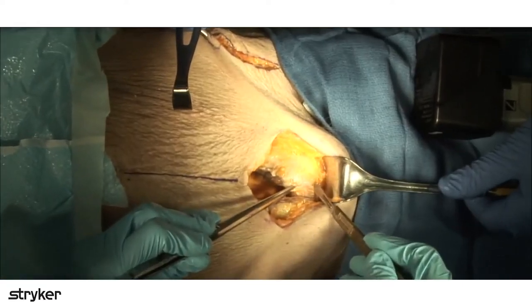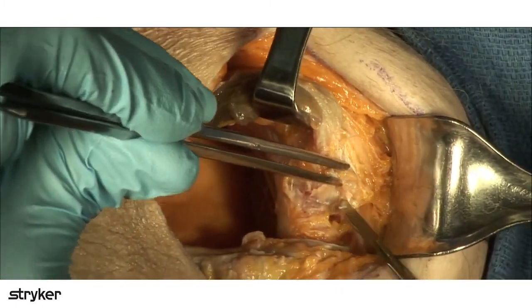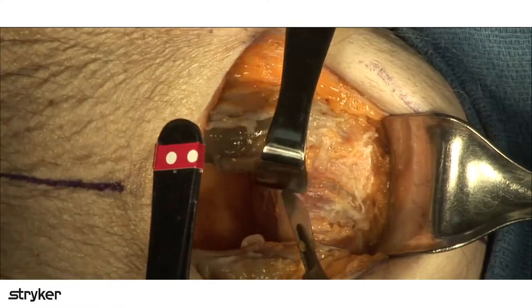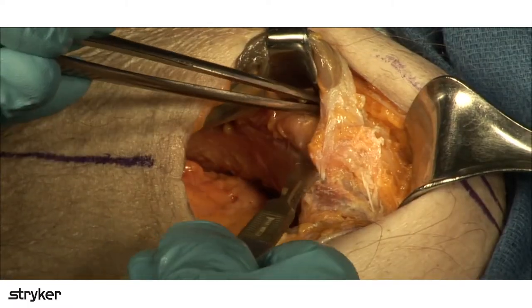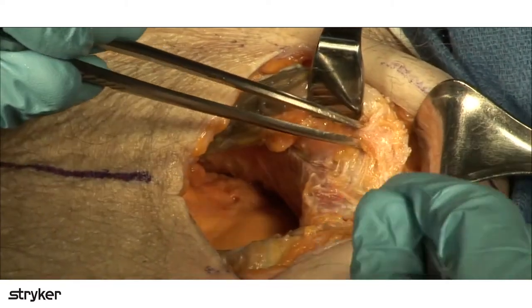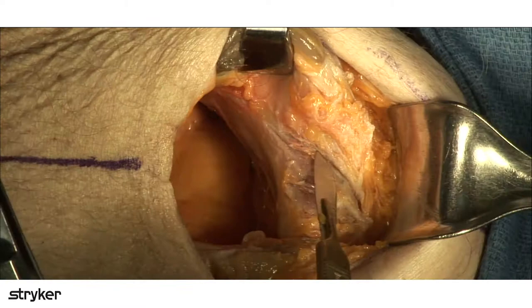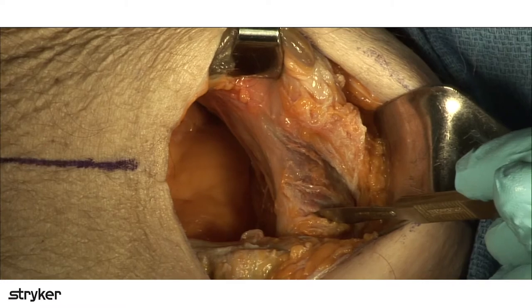You don't want to transect it this way, but if you keep releasing it off of the pubic body from the midline and then coming across in this direction and coming down the front of the pubic body to some degree, you can already see how much more I'm able to take the rectus laterally over towards the side of the injury. I'm still leaving the rectus attached distally and anteriorly on the pubic body. We're just feathering some of it off, so that we can get it to retract laterally a lot more, so it's not stuck and tethered here at the midline.